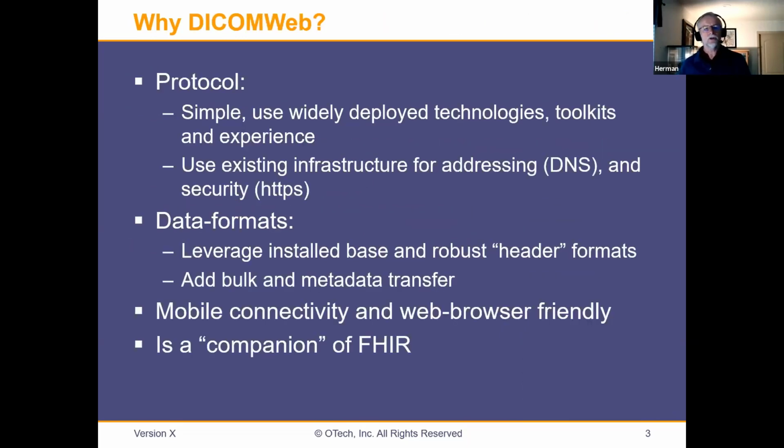So DICOMweb has a protocol, and it's very simple. It uses widely deployed technologies. When you buy something on Amazon or buy a ticket on Travelocity or Expedia, everybody uses web services, right? A lot of toolkits, experience, people coming out of school right now.